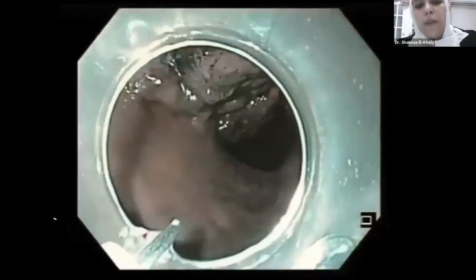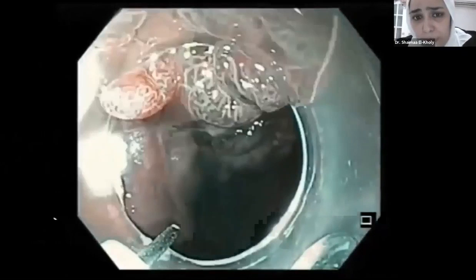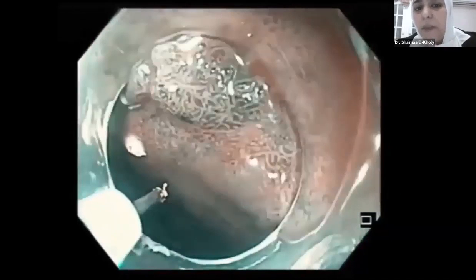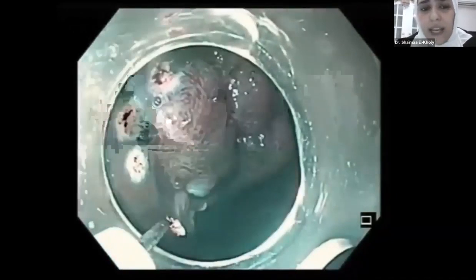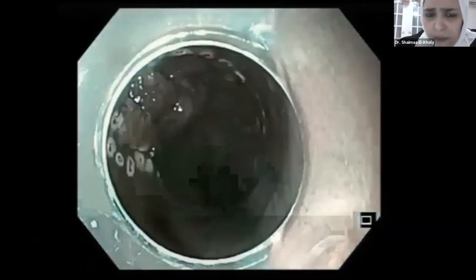We will start with marking the lesion. It's very important to mark the lesion here with the narrow band, as part of the lesion was not obvious before the NBI was applied. And it's very important that you clean your field very well and you inspect every part with narrow band or chromoendoscopy, just to guess if there is a suspicious invasion or not. And as we finish our marking, we see that the lesion is big. It's occupying about 70 or 75% of the circumference.